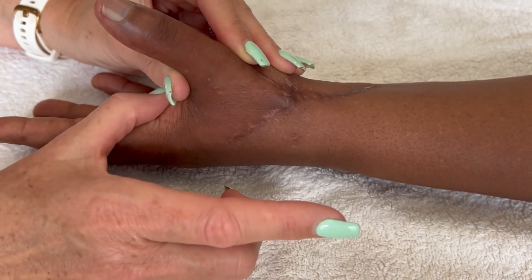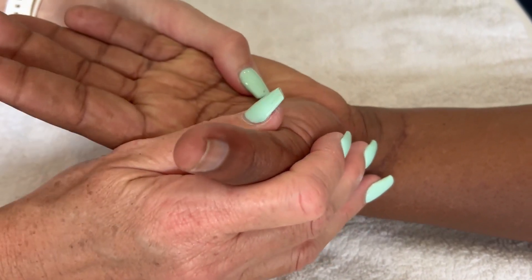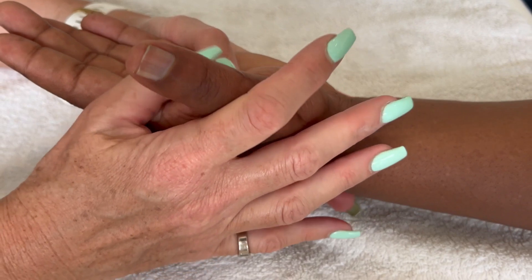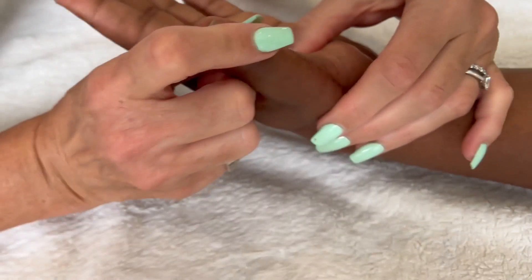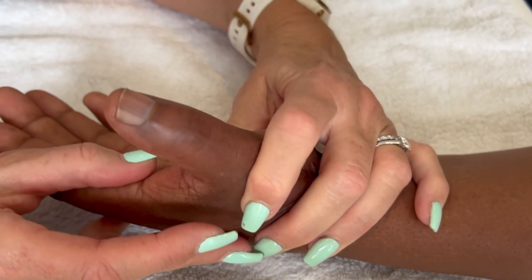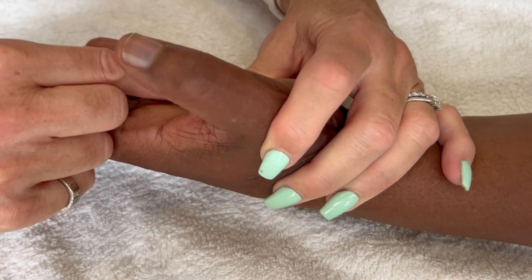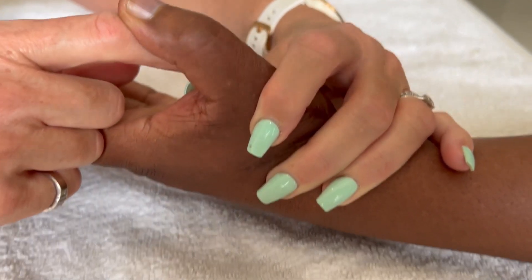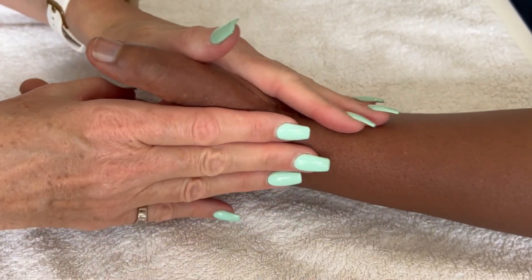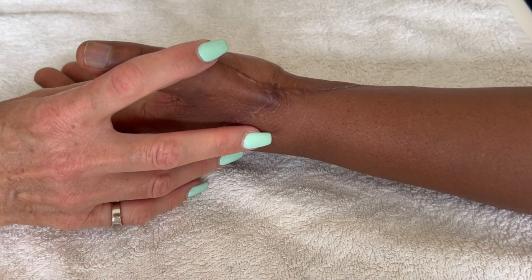It's a tricky cast to make because normally when I use the Sims technique for the thumb, I'm just blocking the MP joint to gain IP joint motion. But this gentleman has driven two hours to see me and I can't see him for a few weeks. So what I want to do is be very clever with how I position the thumb. Let me simulate it — I'm bringing your thumb over. Now bend for me. So you're positioned to move, and then the cast is going to massage your scar and actually stretch this tissue to try and get some range.